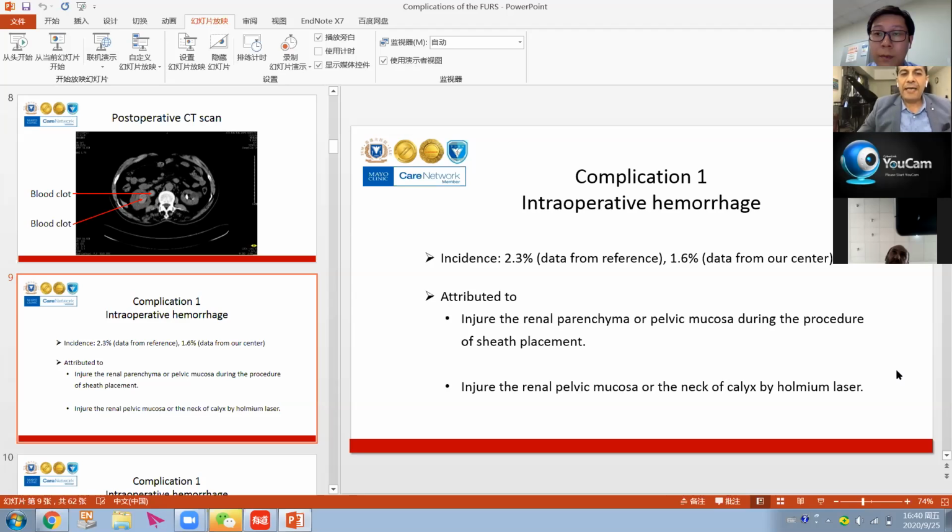Actually, I will share our experience in that. We are not using the contrast material routinely in all cases, but yes, sometimes we do that if we are expecting complex renal anatomy or we have multiple stones and we cannot figure out some narrow calyces. So retrograde pyelography can be helpful, but it is not a routine procedure.